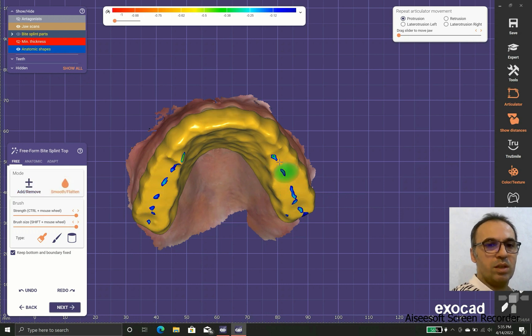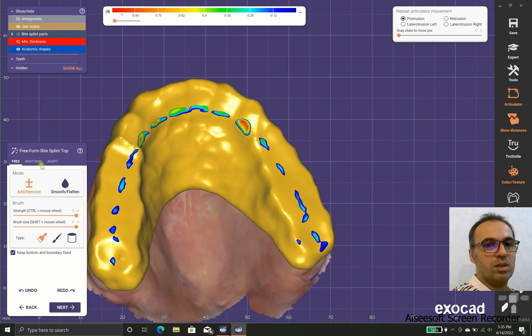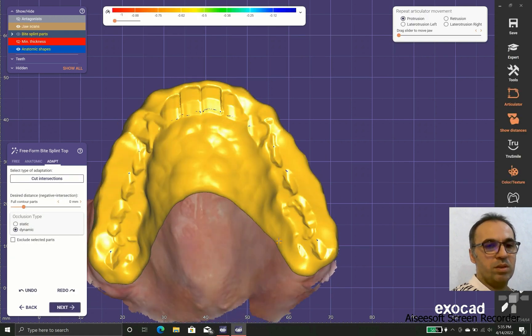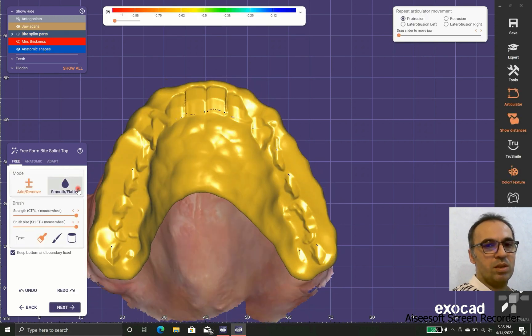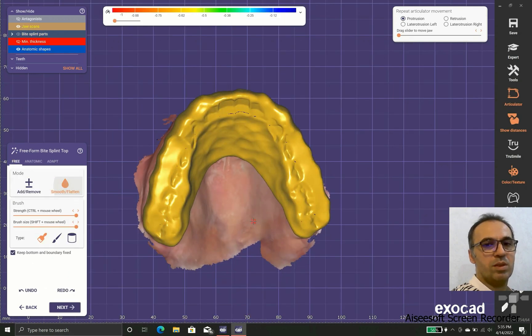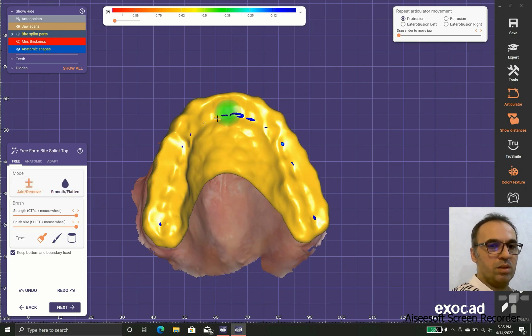Of course we still need some occlusal contact, because if we have no occlusion with our teeth they will super-erupt, and that is not our goal. After smoothing, we repeat this process two or three times until we have almost reached the final goals.